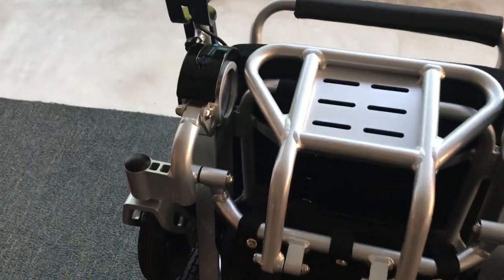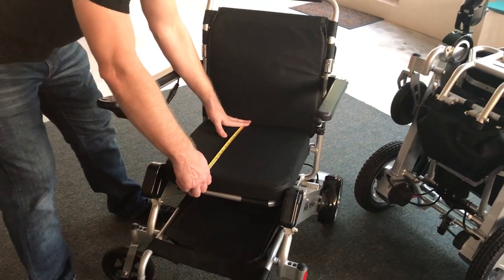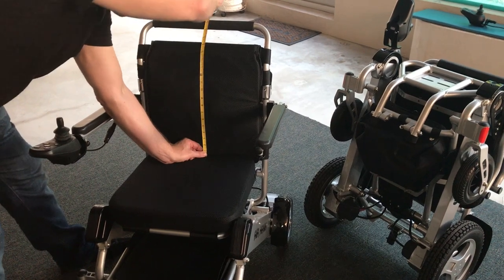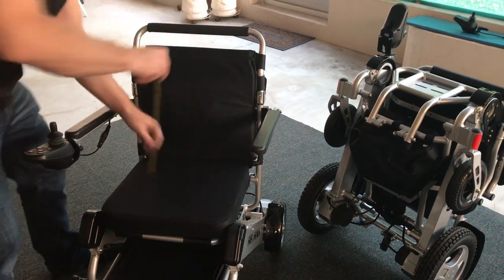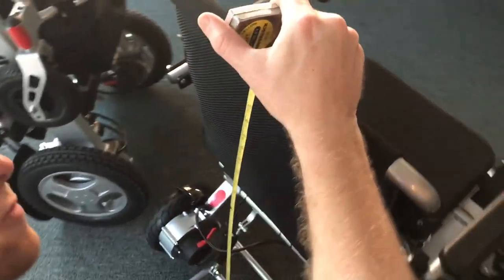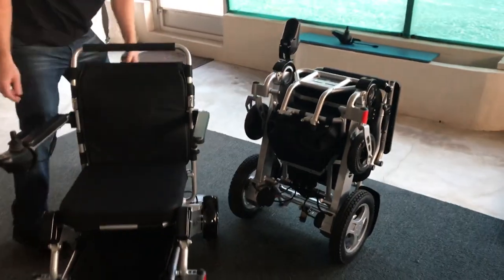Before moving on to the Eagle, a couple more measurements with the Air Hawk. The depth of the chair here is about 15 and a half inches. The seat height is about 16 and a half to close to 17 inches. The handlebar is about 20 inches from the seat to the top of the handlebar, and all the way to the ground we're looking at about 35 and a half inches to the top of the handlebar.